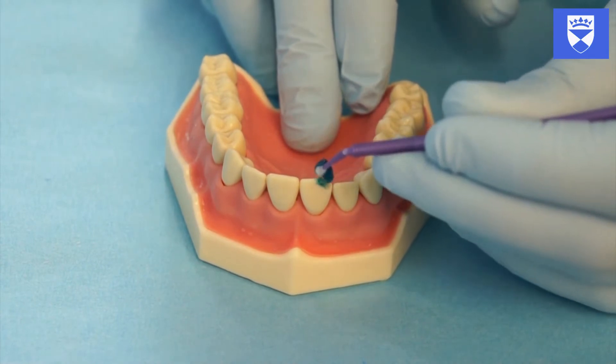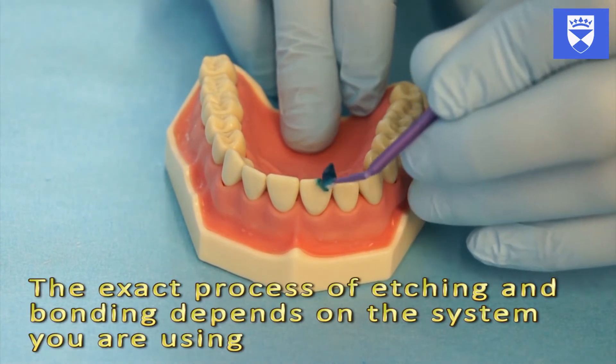Etch the enamel and dentine to be covered by composite. This should be done for 20 seconds.